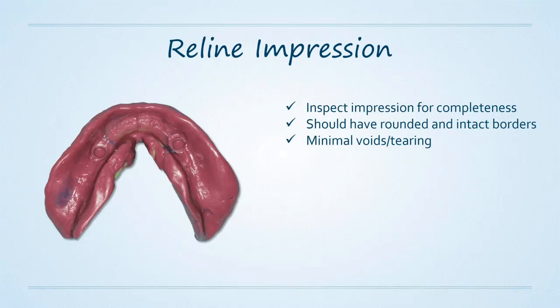Assuming that your denture is pretty close to being proper, meaning the proper borders and the proper contours, everything should be a pretty straightforward procedure. Many times you can use just the monophase or the regular body PVS without having to do a lot of border molding and still do a good job.